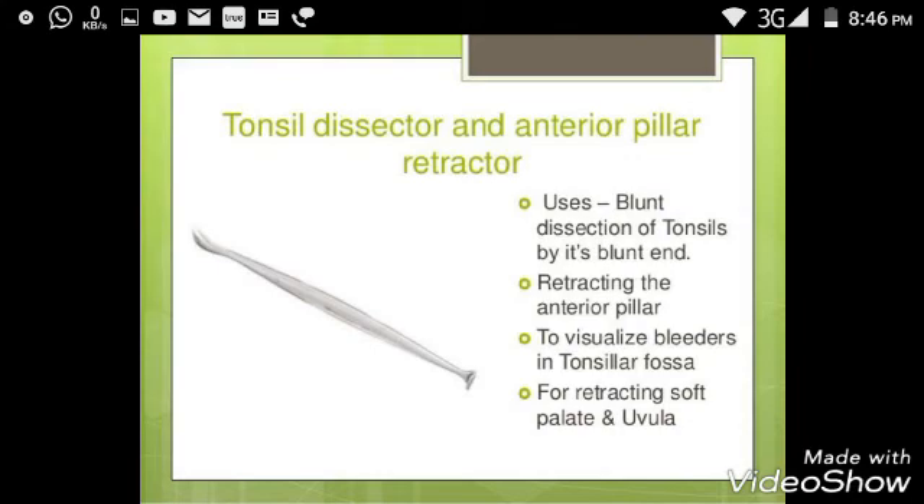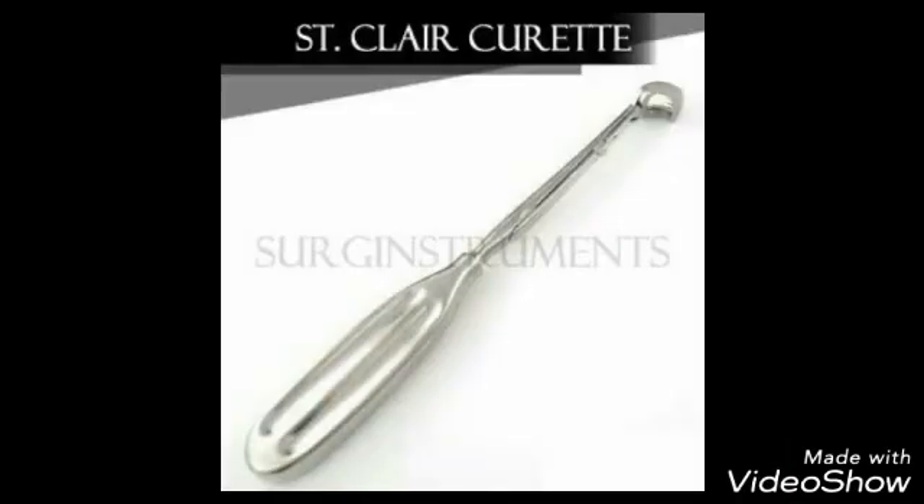It is the Tonsil Dissector and Anterior Pillar Retractor, used for blunt dissection of the tonsil by its blade and for retracting the anterior pillar.